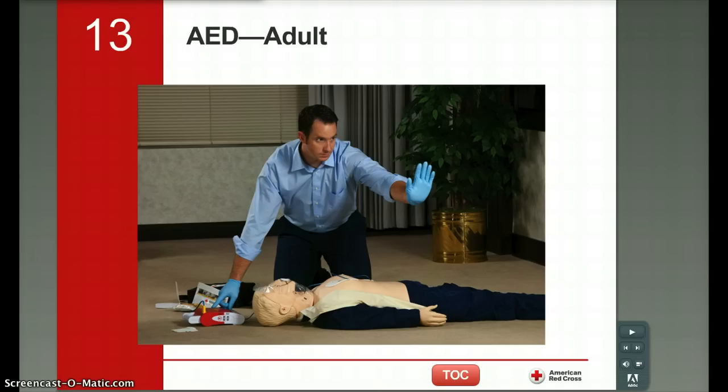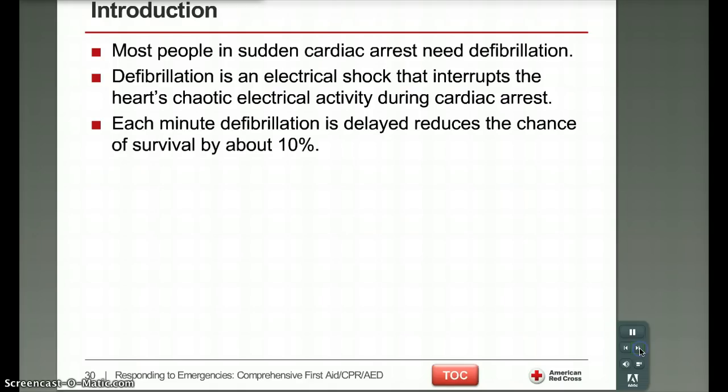The nice thing is even though we're going to discuss how to properly use an AED and some of the precautions that we need to take, somebody who's never used an AED before could use one, because many of them are set up in such a way that even if you've never used one, it walks you through step by step how to properly use it. AED, once again, stands for Automated External Defibrillator.